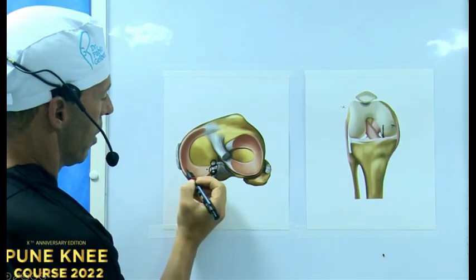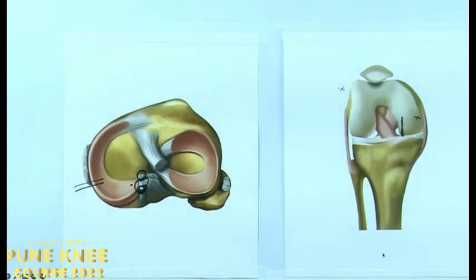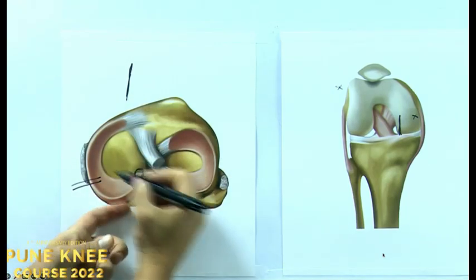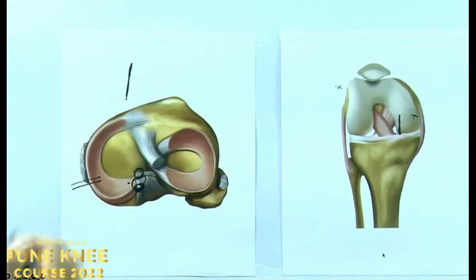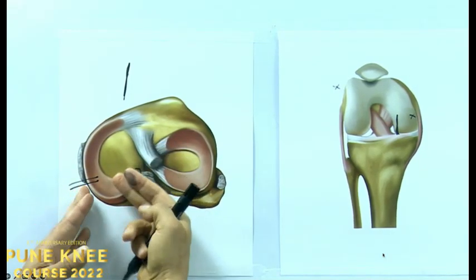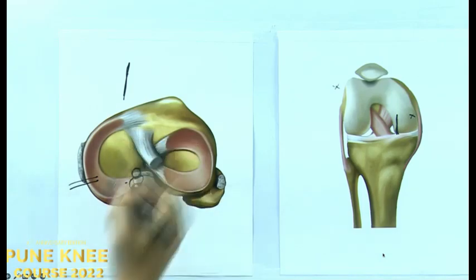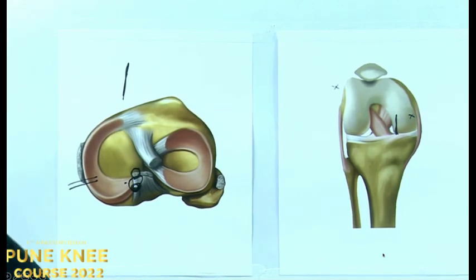When we have this, we will also place two spinal needles to help introduce the allograft. We will introduce the allograft through the large medial portal, and once it is inside, we will stitch it in the posterior horn, and finally we will calculate where the anterior horn tunnel has to be done, because in some cases, putting the stitches against the capsule can make the graft unable to fit or reach the anatomic position. So first this, and the last step will be the anterior horn tunnel to finally fix the allograft.